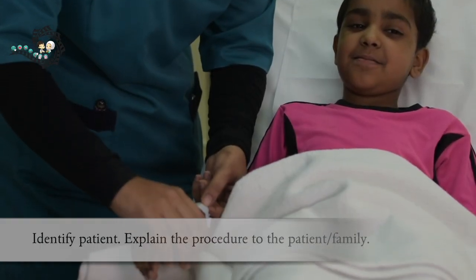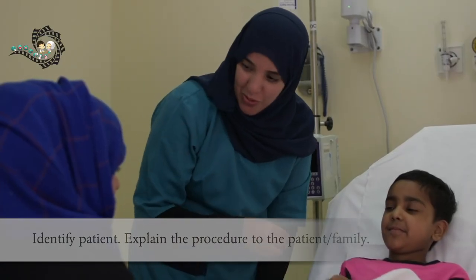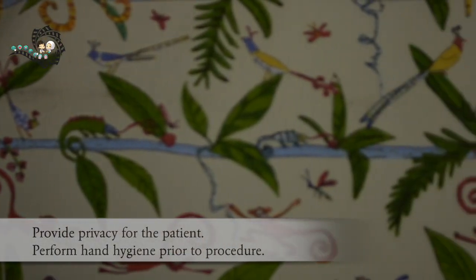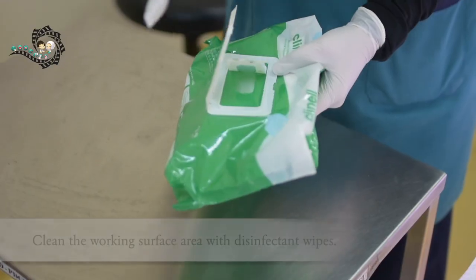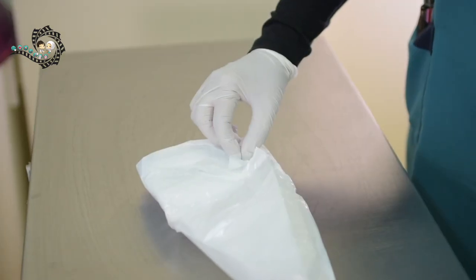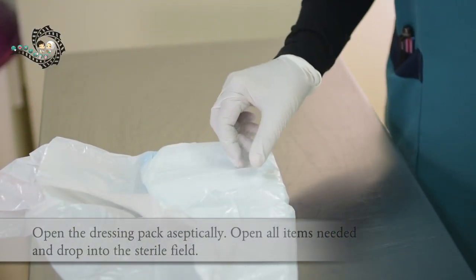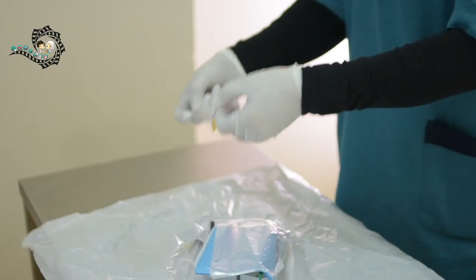First, we have to identify the patient, then explain the procedure to the patient and family. Provide privacy for the patient. Perform hand hygiene. Clean the working surface area with the disinfectant wipes. Open the dressing pack aseptically. Open all items needed and drop into the sterile field.